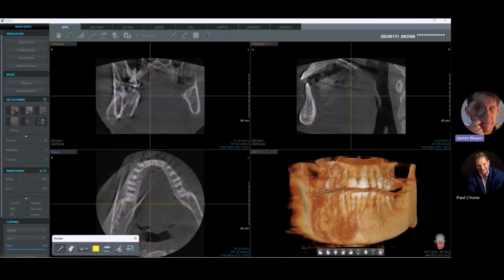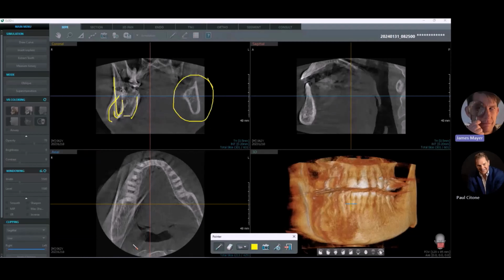Yeah, I agree. I'm following the ramus down here, and as you described, here's another ghosting. You can see a lot of ghosting through here, whereas on the patient's left side, look how clear it is, which also translates in the mandible, the patient's right side versus the left side. Yep. That's a very good example of recognizing patient movement within a scan.